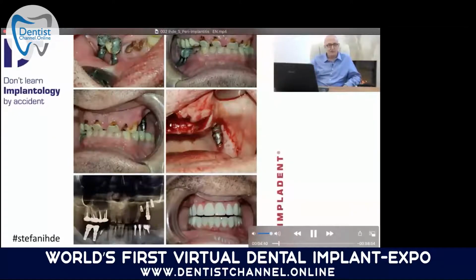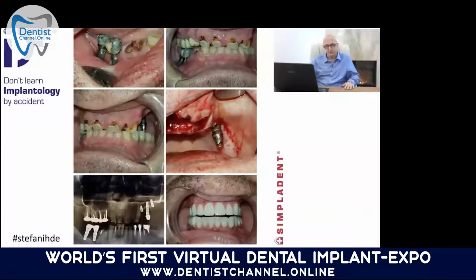We removed everything. We removed the remaining teeth. We removed all these ailing implants and placed fixed teeth within a few days. Typically, we do this in 3 days. So it's not a problem nowadays, and by our means, by the corticobasal implants, to get such a problem solved.